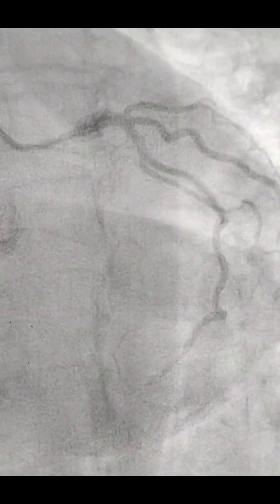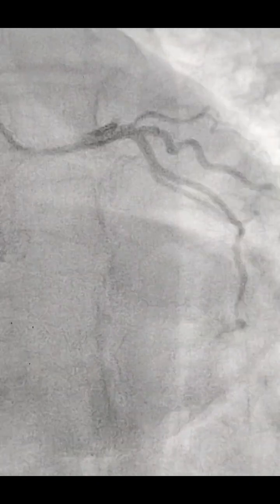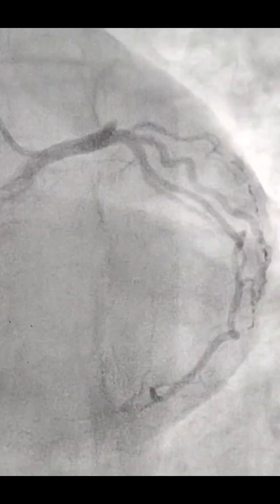So this is a 55 years old female, a known case of diabetes recently diagnosed, and she presented with chest discomfort since morning, within 4 hours of her chest discomfort, and she has autonomic symptoms. They went to some local hospital and they took an ECG, and the ECG showed a hyperacute T wave in the anterior leads and ST coving.